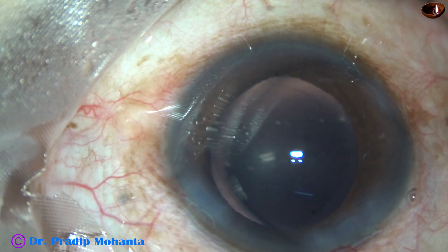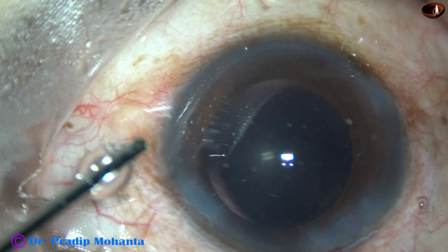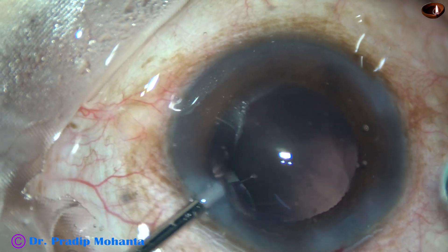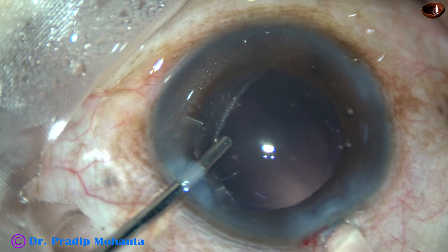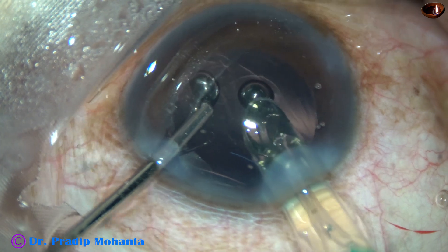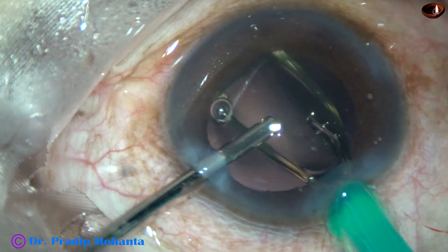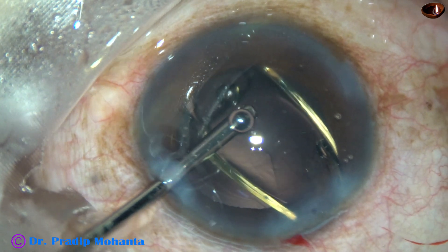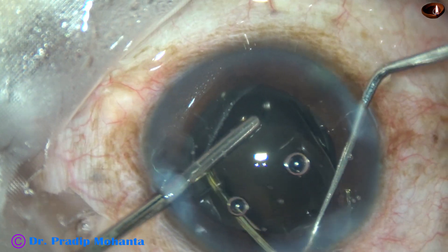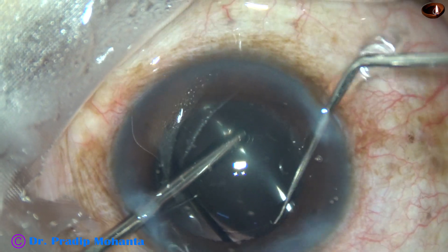Now it is time for implanting an intraocular lens. A hydrophobic acrylic single-piece monofocal intraocular lens is implanted in the capsular bag. The leading haptic has gone into the capsular bag, but the trailing haptic is still in the angle just in front of the main incision. I take a Sinskey hook, go through the right side port, and place the intraocular lens fully in the capsular bag.